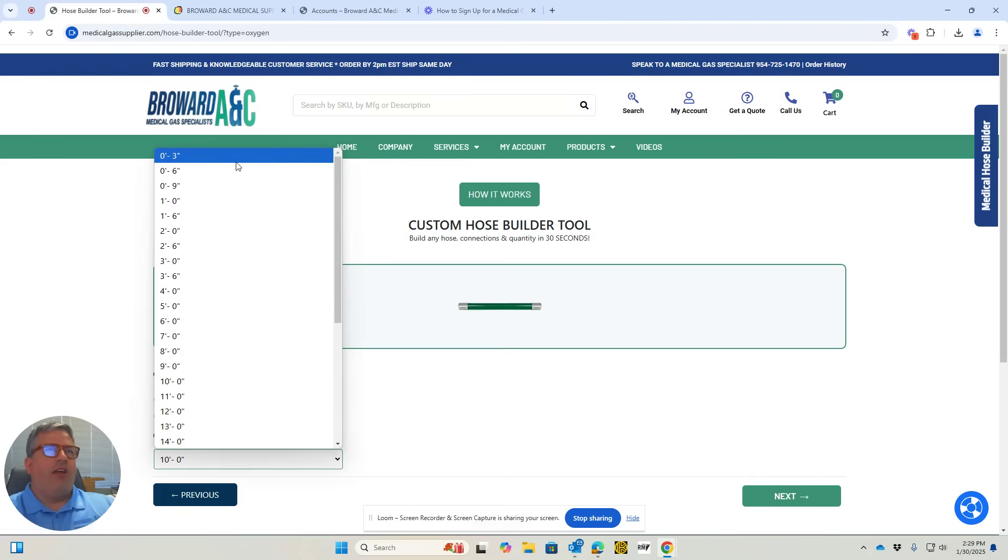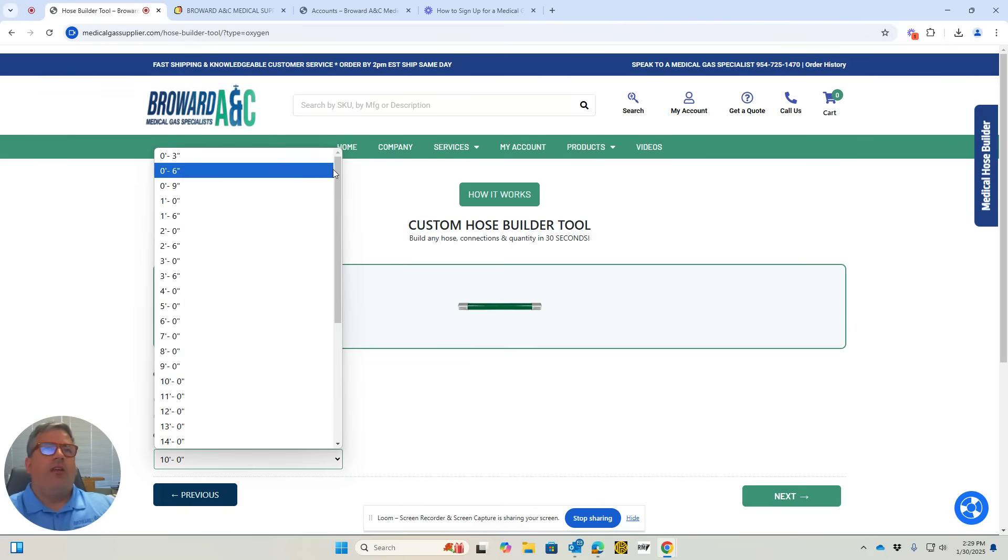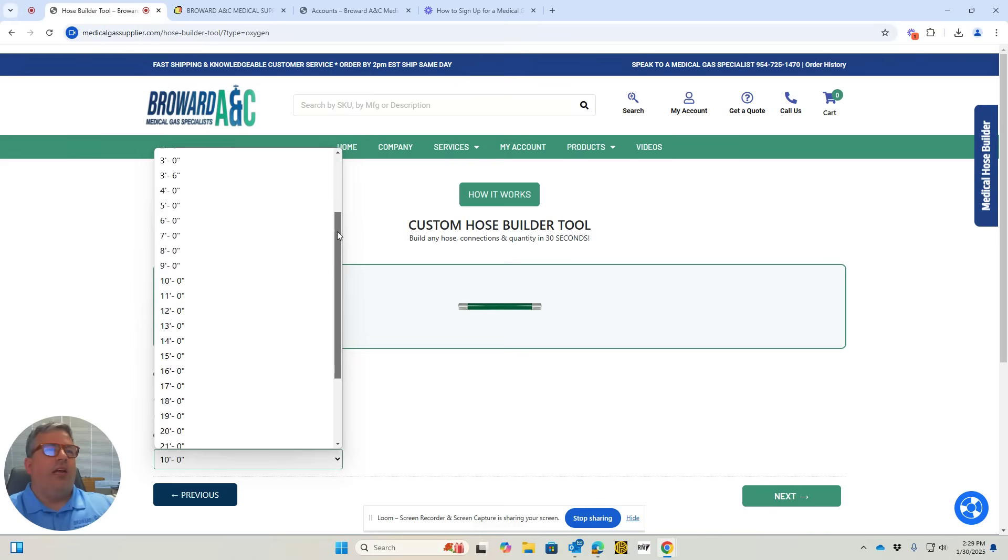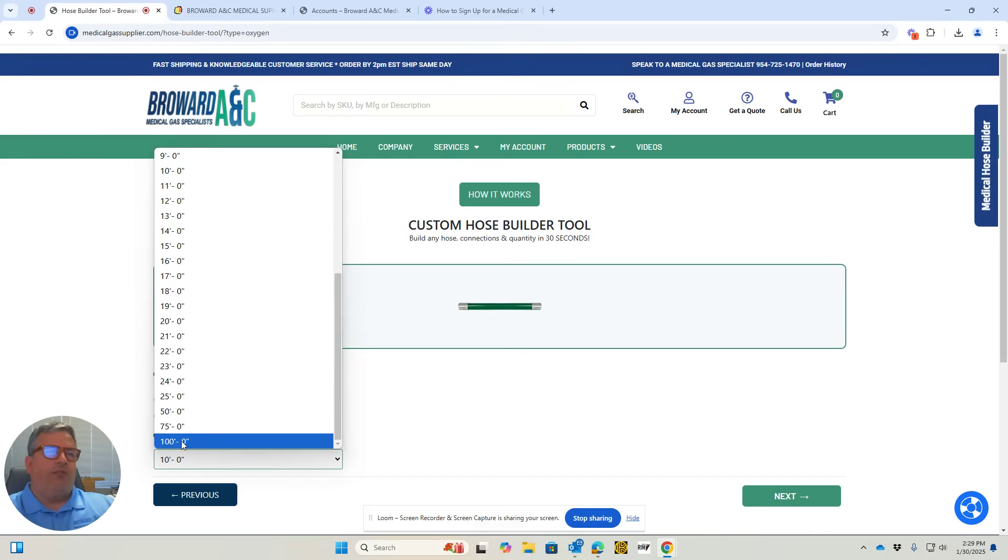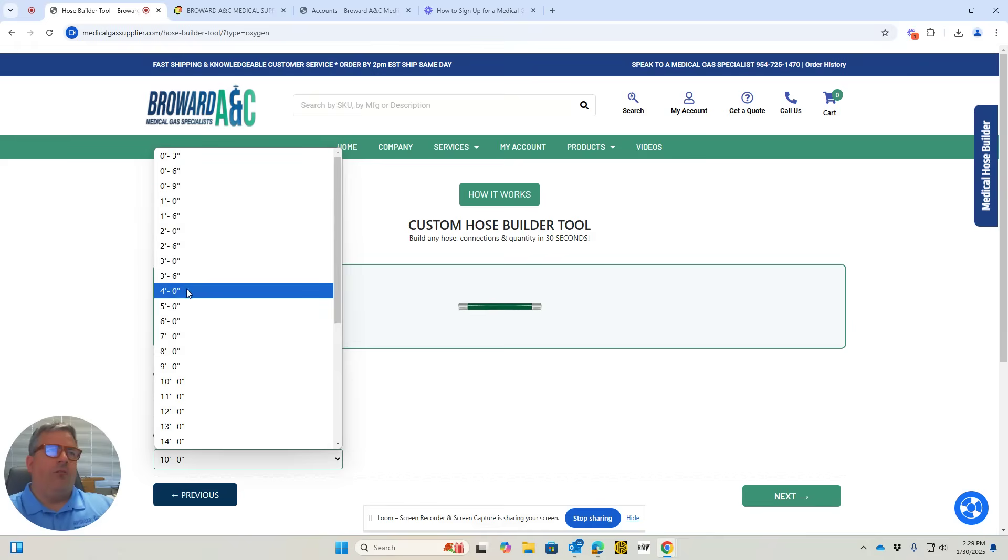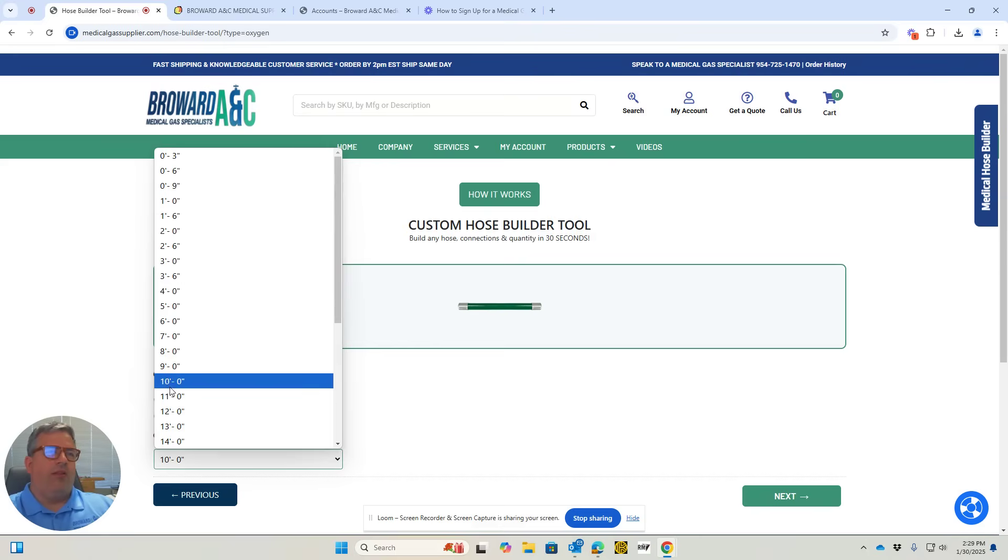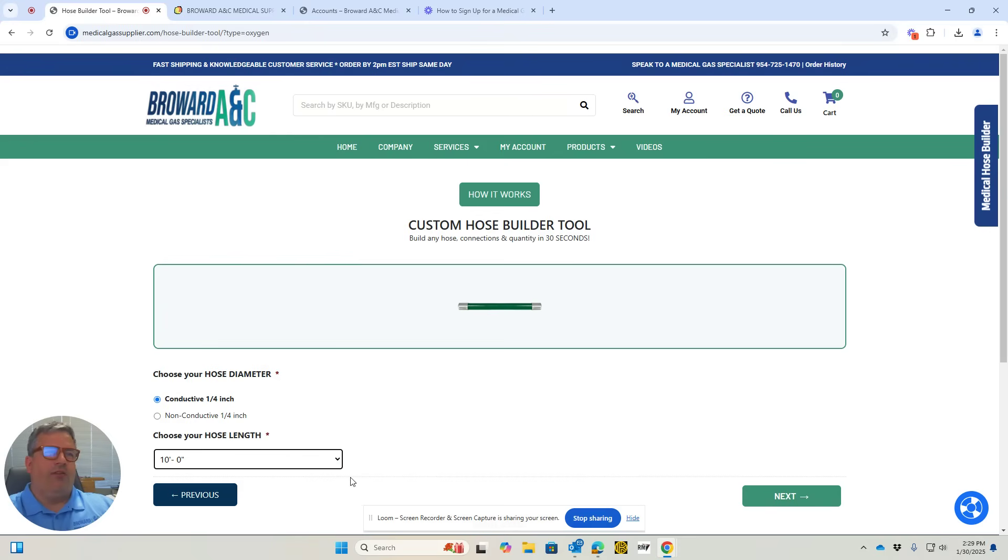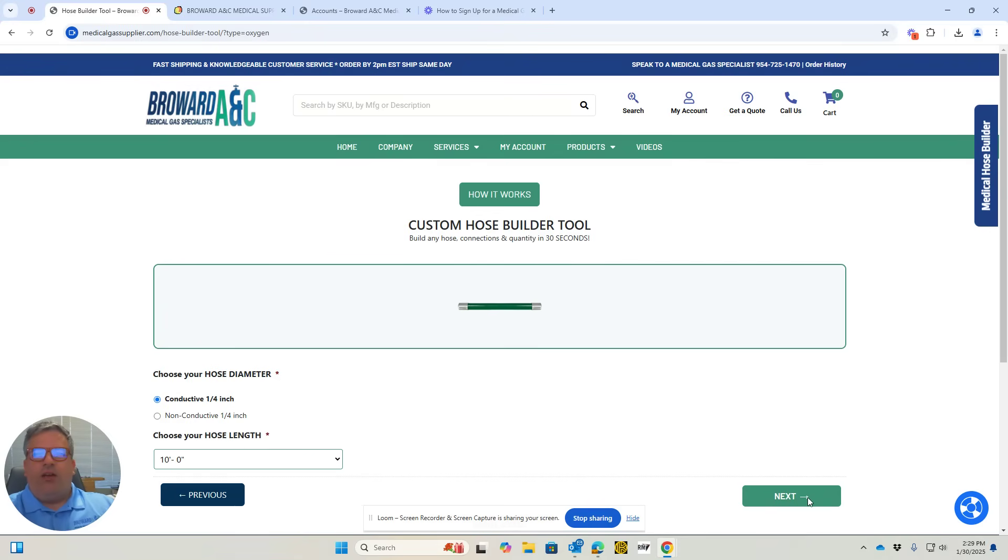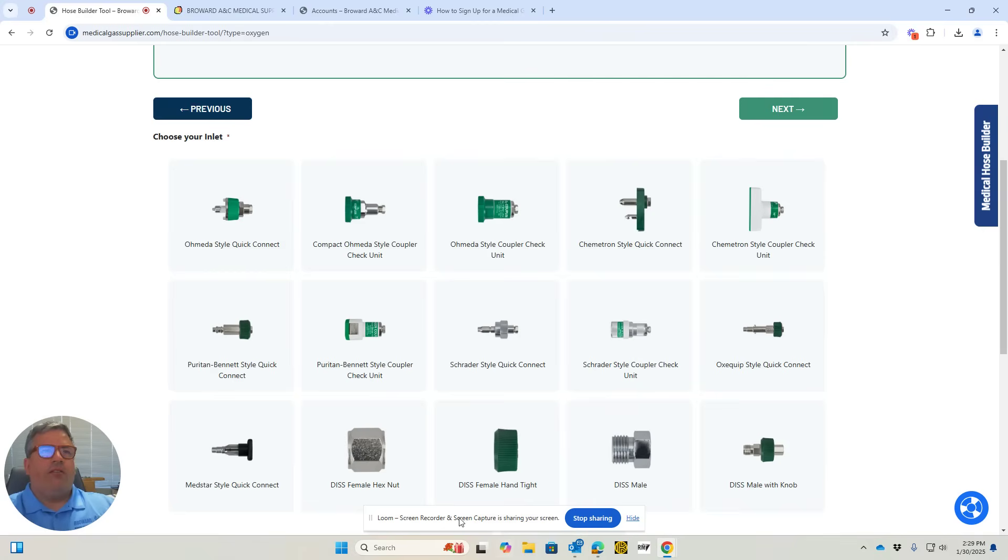You can choose your size anywhere from three inches, which I don't think we've ever sold, all the way up to a hundred feet of hose. Most people order about ten feet of hose. So here's a ten-foot hose. Let's go ahead and hit next.